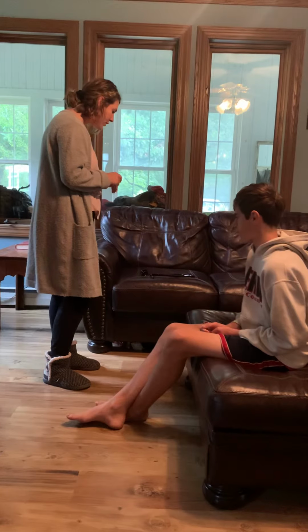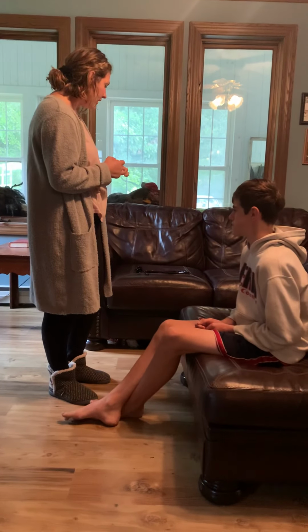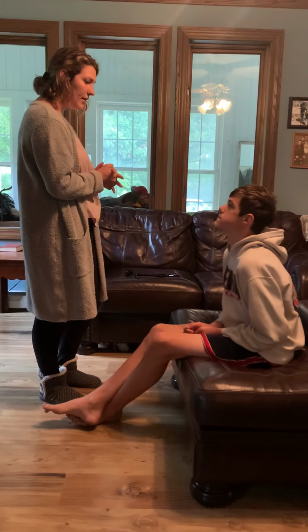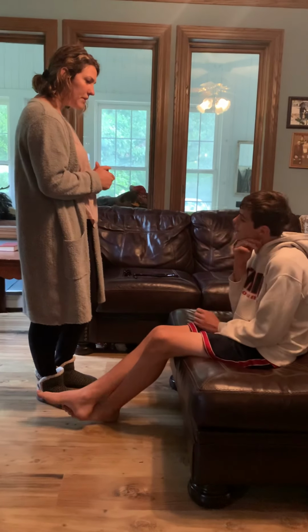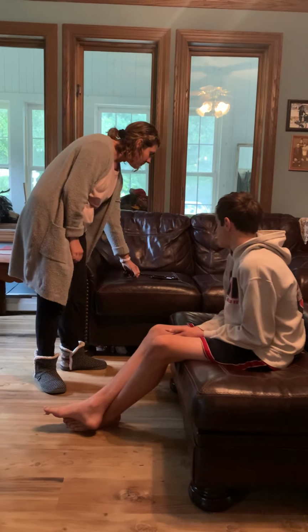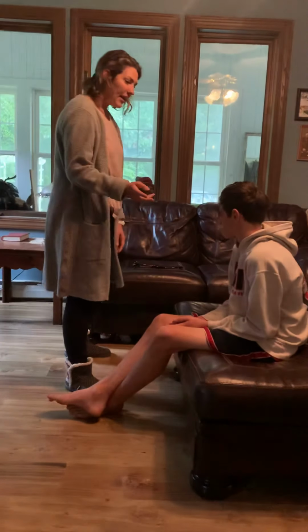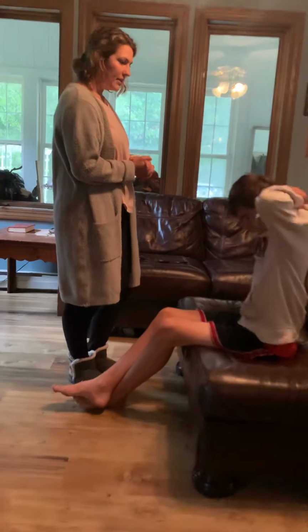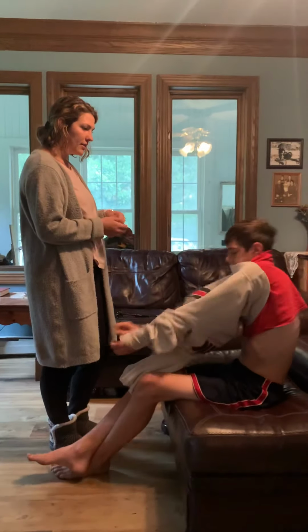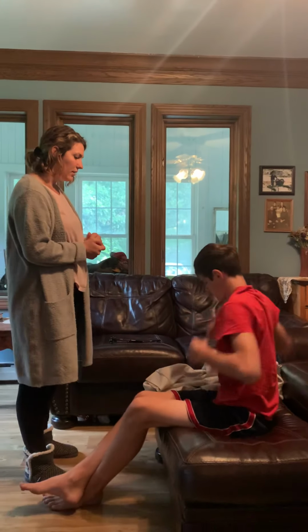It looks like he wants me to do a respiratory assessment on you today, so we'll give your lungs a listen. Would that be okay? Alright, and are you sitting in a comfortable position? Yeah. Alright. So I have my necessary equipment here, my stethoscope, and it has been disinfected. Can I have you take off your shirt just because it's easier to get to and easier to listen? Not supposed to listen over clothing. We might pick up sounds that aren't there.